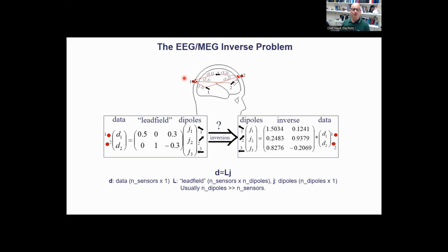Regularization is probably the most important topic in source estimation that we usually don't talk about. Sometimes you don't find any information about this in papers, but it is potentially something that affects your source estimation and the interpretation quite a lot. Let's just go back to the beginning.